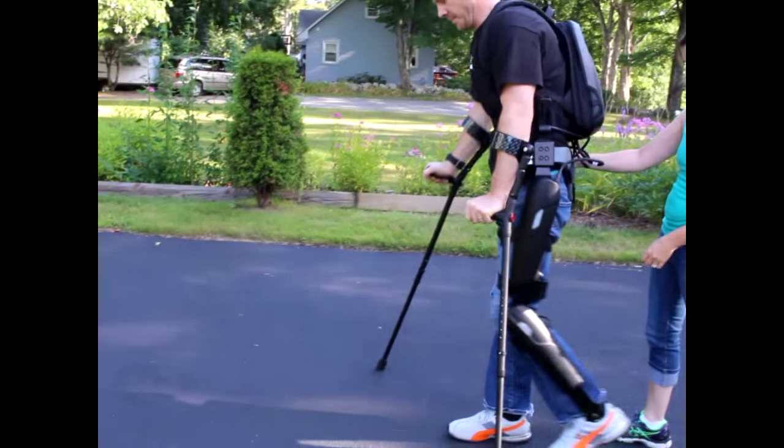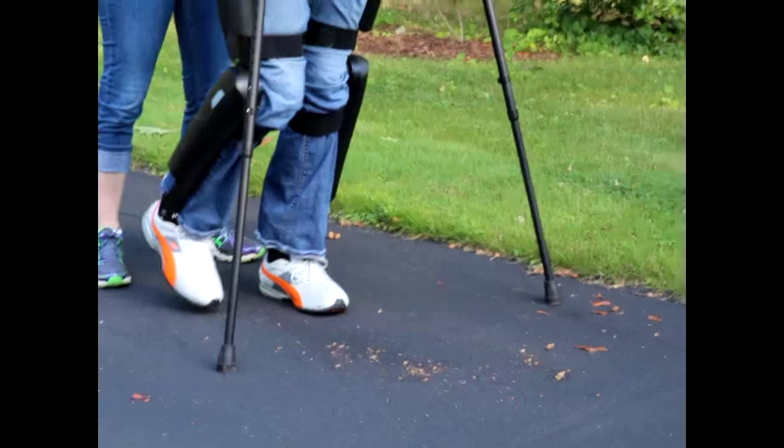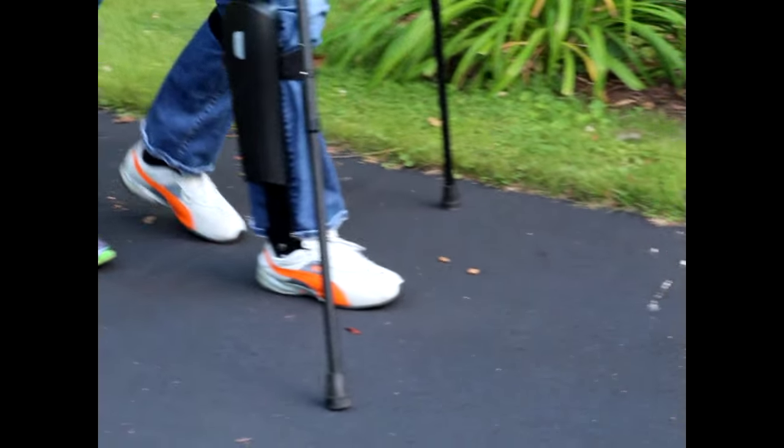As I become comfortable with it and more used to how and when I need to weight shift and balance, you sort of let the machine do the work for you. So it's not as much work as it looks on my arms and shoulders.